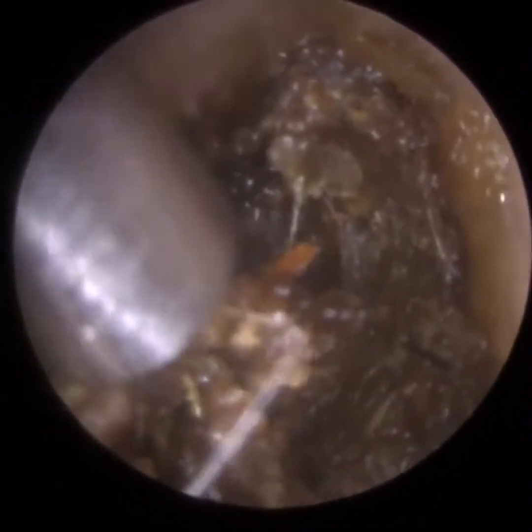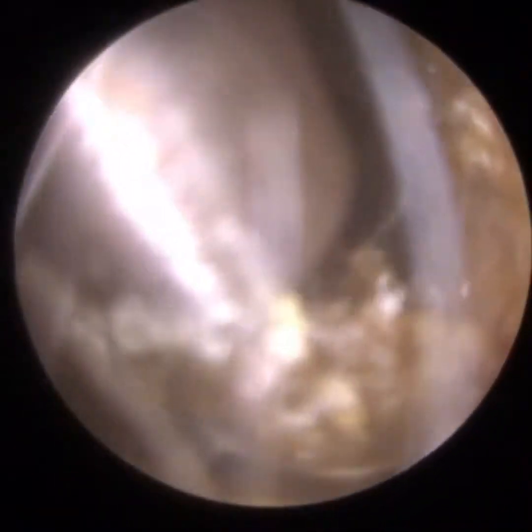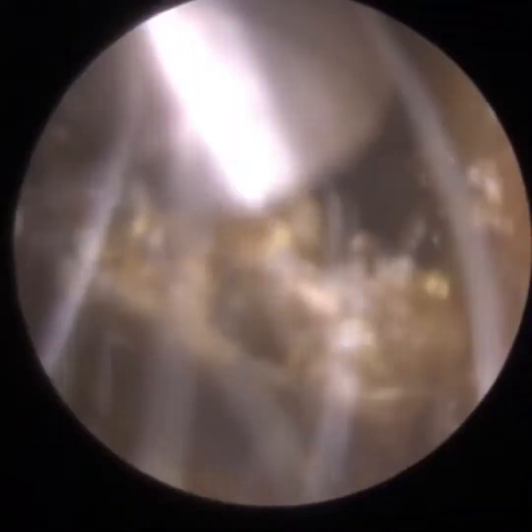And so there's quite a significant blockage here. I had to use an ear hook just to break up the plug of wax, so it enables me to then suction it out of the ear. So this is the lateral posterior canal wall. There's a crusted piece of wax here, and if I can elevate this off the canal wall as I am, it will then loosen the entire plug, which enables me to remove it out.